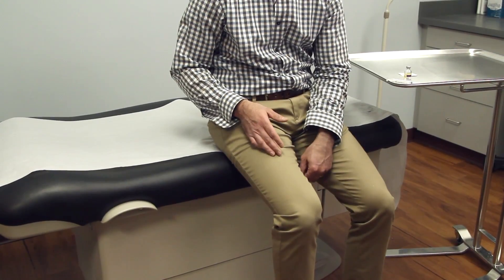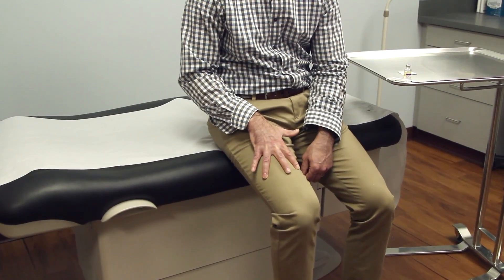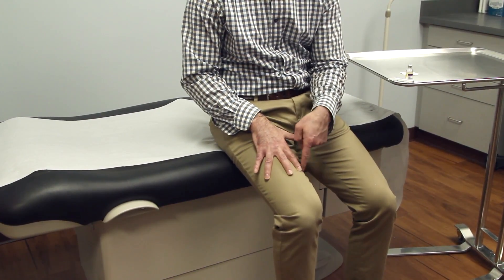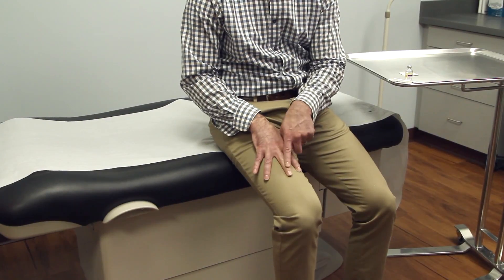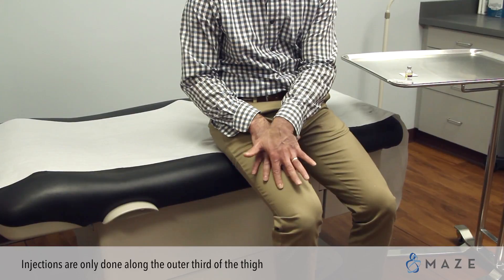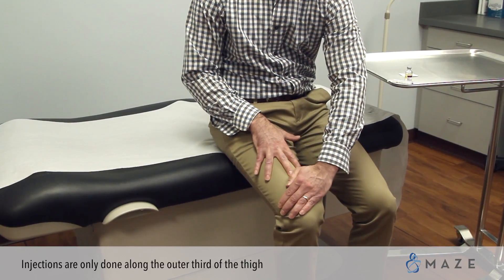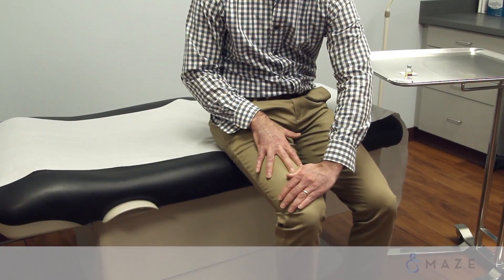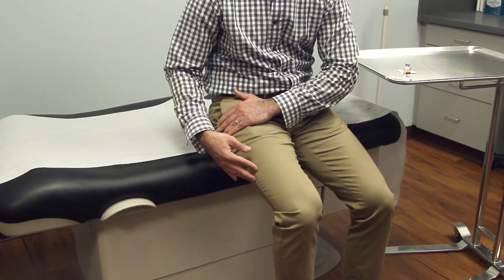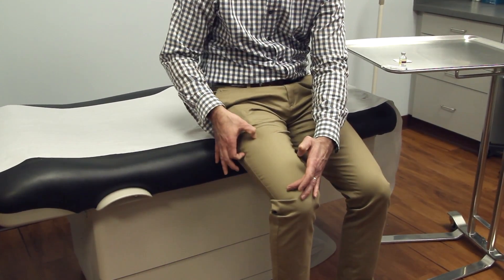The easiest way to do an intramuscular injection into the thigh is to put your three fingers on your thigh. We don't do any injections from the middle finger on to the left — injections are only done along the outer third of the thigh. We never go by the knee, so you want to do a hand breadth up from the knee and stay a hand breadth down from the groin. The area of the injection is right along the vastus lateralis.